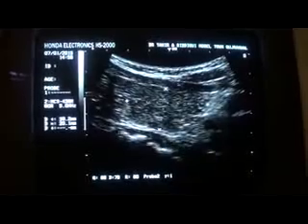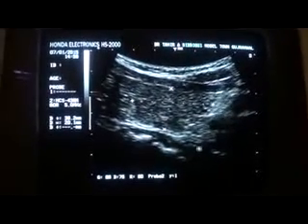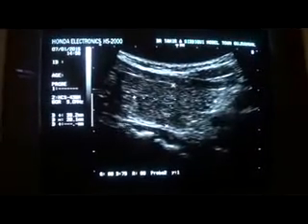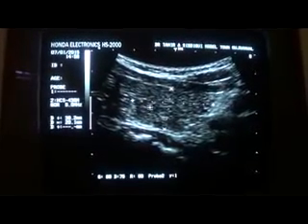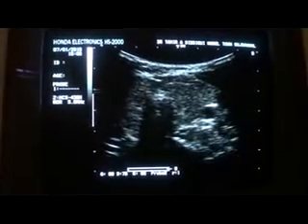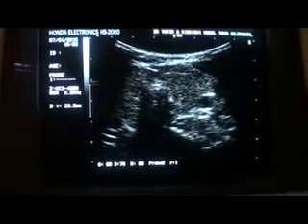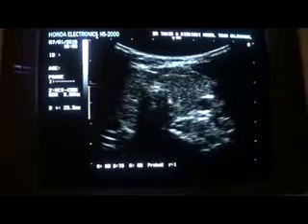This is the common carotid artery in the longitudinal section as a landmark for the identification of the thyroid gland. It ensures us that we are seeing the thyroid gland and not some other structure. So approximately 4 by 2 cm is the dimension, and 4 by 2 by 2.3 cm — this is how we measure the normal thyroid gland.